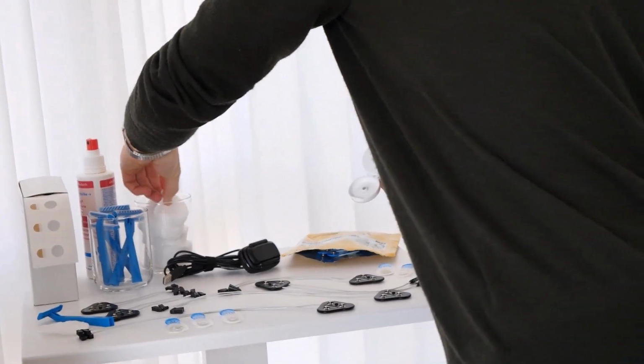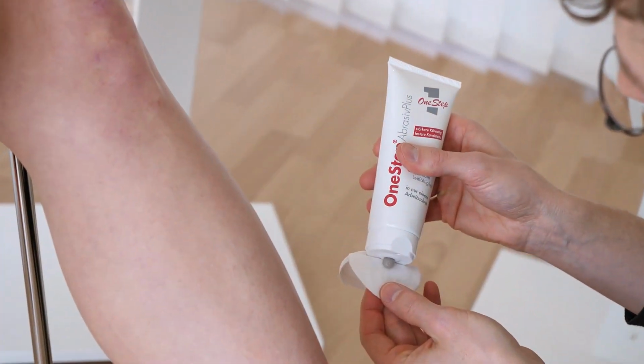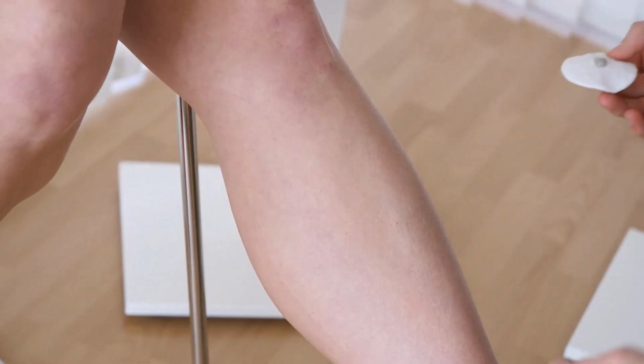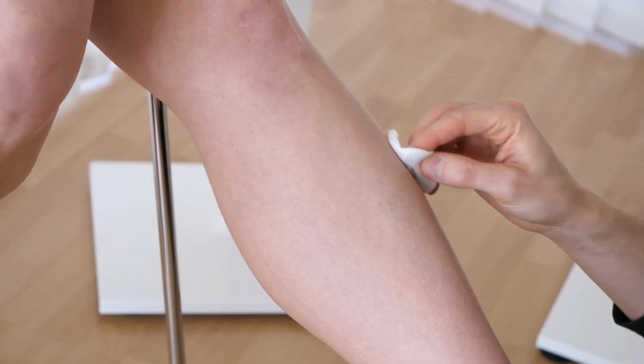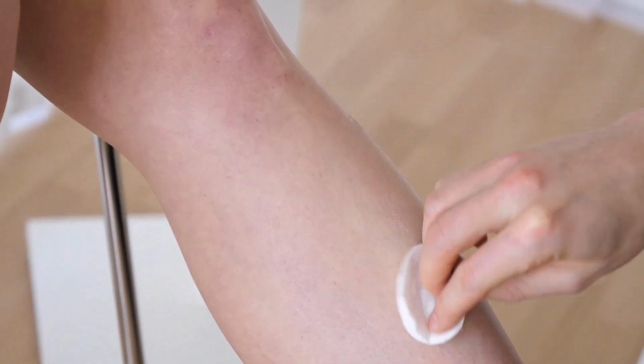As a second step, we recommend the use of an abrasive paste to make the skin as conductive as possible on the surface and to remove all possible interfering factors such as fat, oil, sweat, and the skin epithelium caused by shaving. Optimally, this will make the surface a little rough and the skin will be very slightly red.